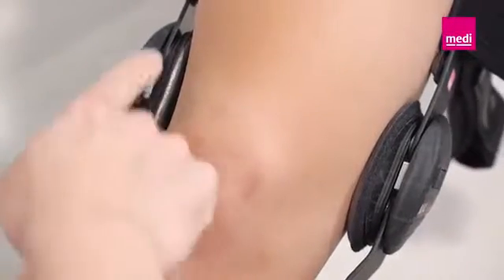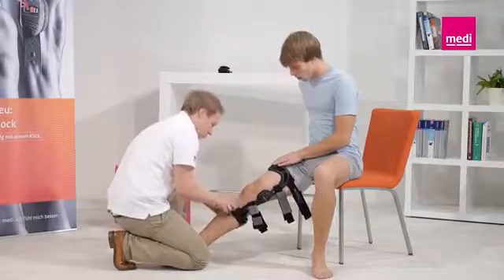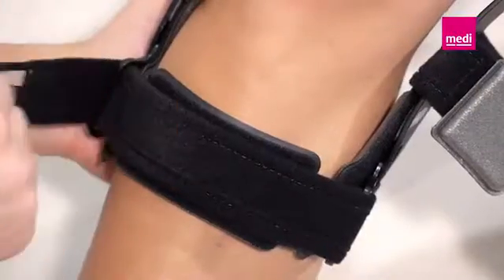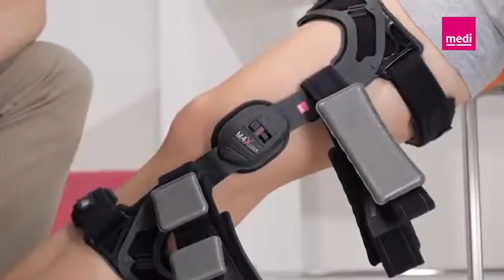kneecap. Make sure that the orthosis is not twisted on the leg. The straps should be secured in the order specified by the numbers, to guarantee the orthosis fits securely and has the optimum effect. Start with straps 1 and 2. The knee should be kept straight.